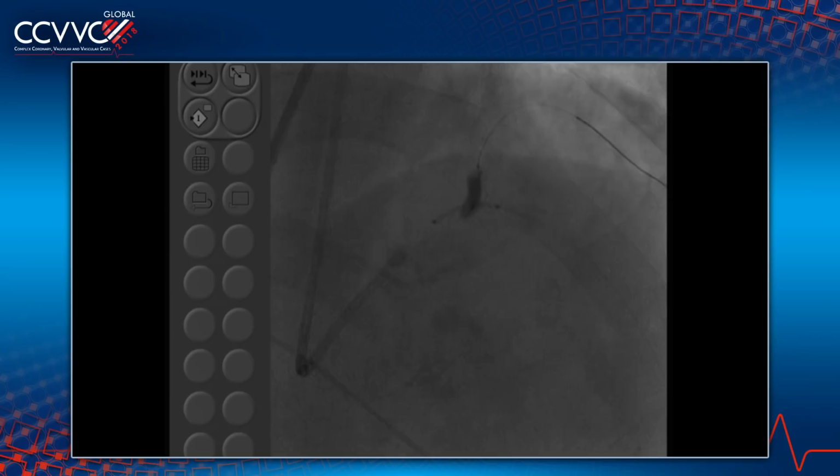You'd be very surprised if you put 100 interventionalists and tell them to do a mini crush case, how it goes. Then you do these steps. You're supposed to know. Otherwise, tell us what's going on here.